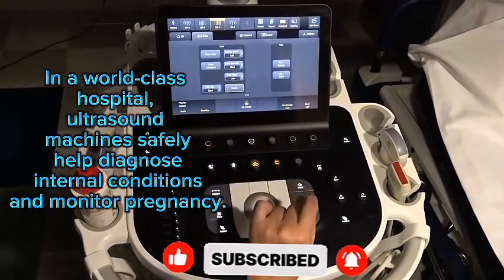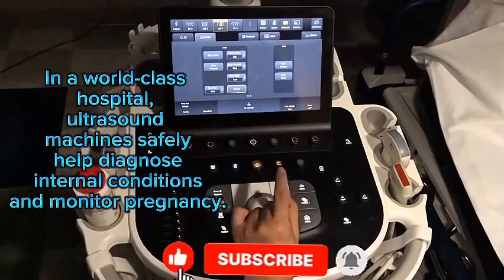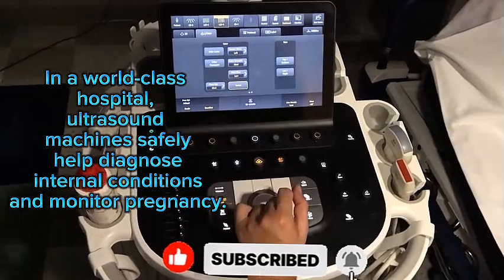If you wanted M mode, you select it here. It will generally also come up even in grayscale in the OB setting.